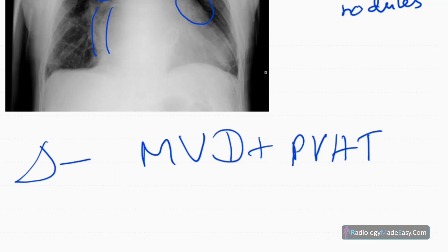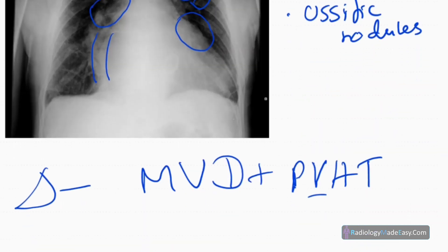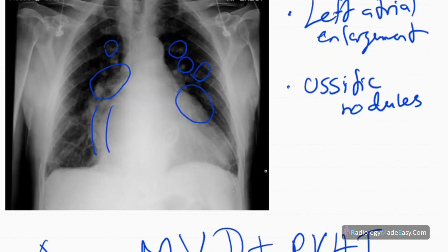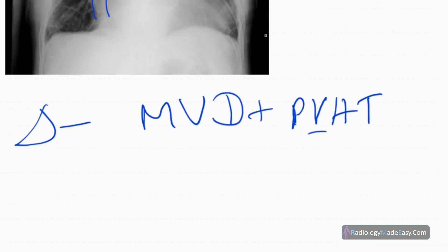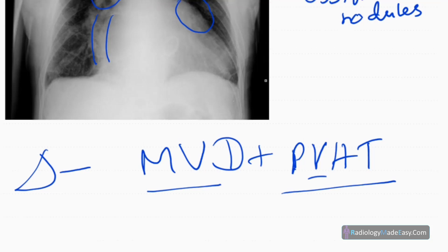Pulmonary venous hypertension is present, and the key features of this disease in summary are: double right heart border, splaying of the carina, mitral valve replacement surgery, enlarged left atrial appendage, enlargement of pulmonary vessels, and pulmonary ossific nodules. So the diagnosis in this patient is mitral valve disease with pulmonary venous hypertension.